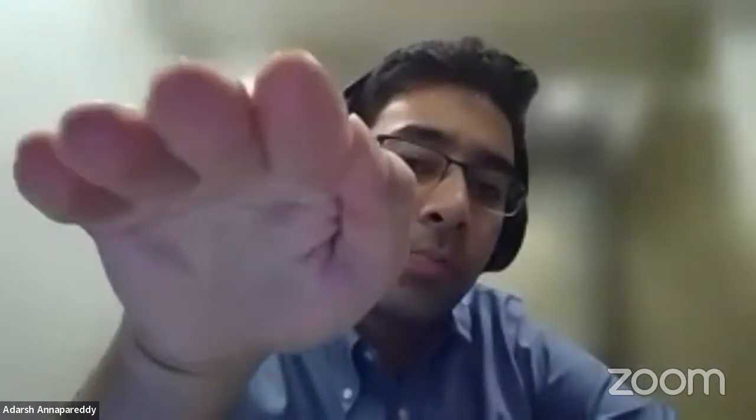It can happen when you're taking your tibial cut and you go a little bit posterior lateral. You had better just stop your blade, come out, and take it out with an osteotome. That way, you can avoid this. But if it does happen, I don't think you should stress too much about it. Just check your laxity in flexion, because it will affect your flexion space on the lateral side. So just make sure that it's stable. If it's stable, that's fine. If you can put in two sutures, as Dr. Ratnakar said, that's good enough.